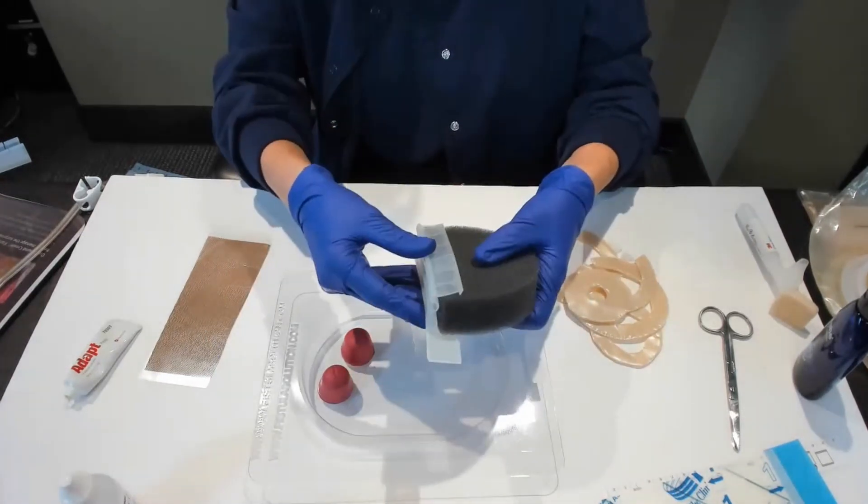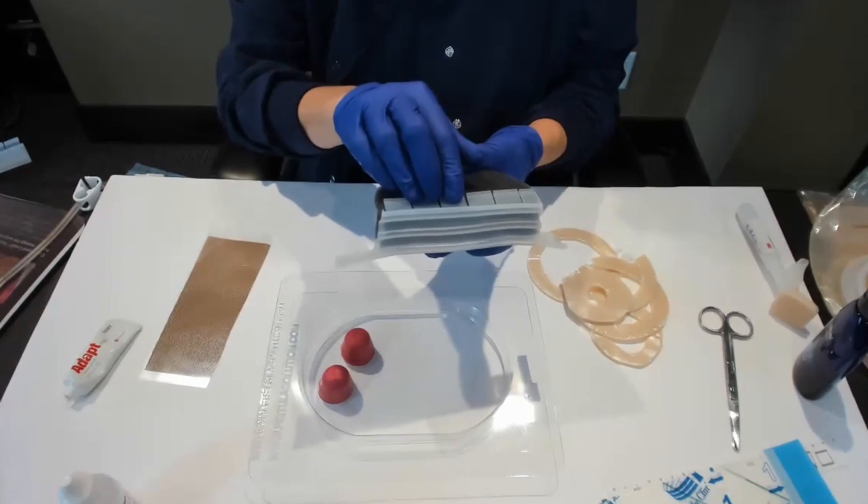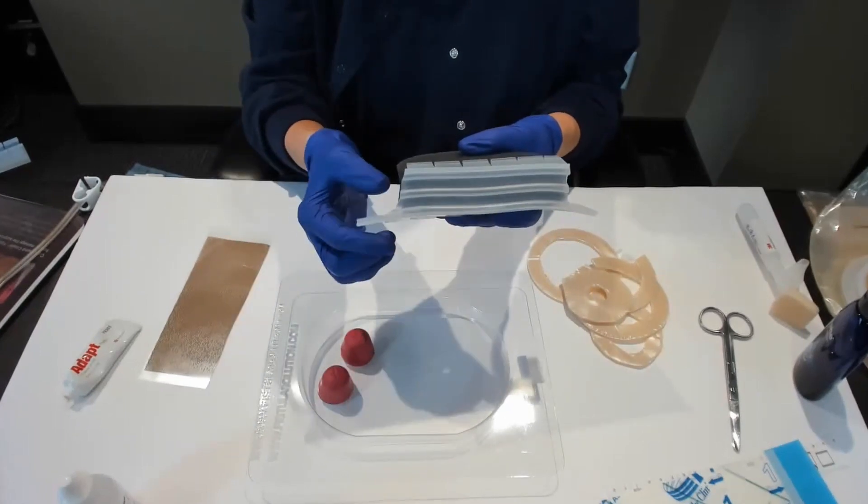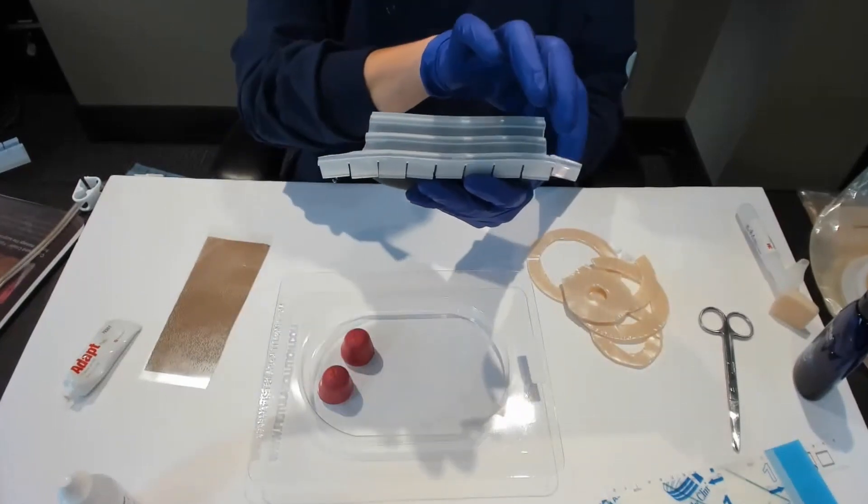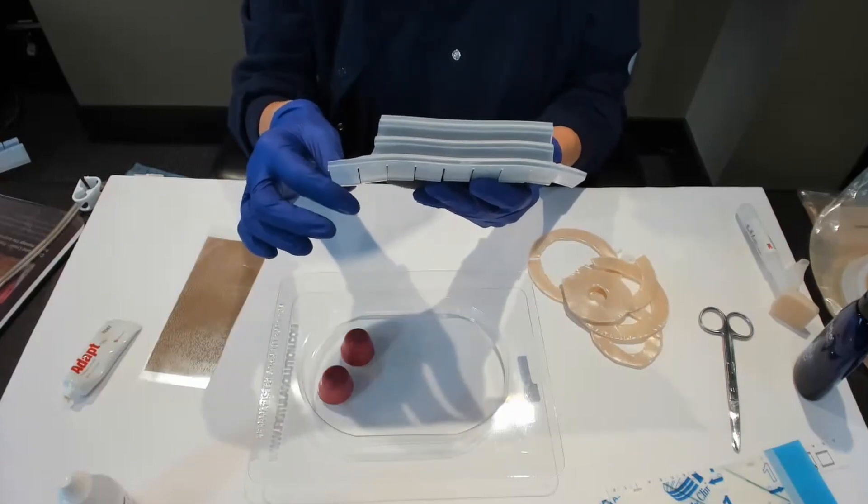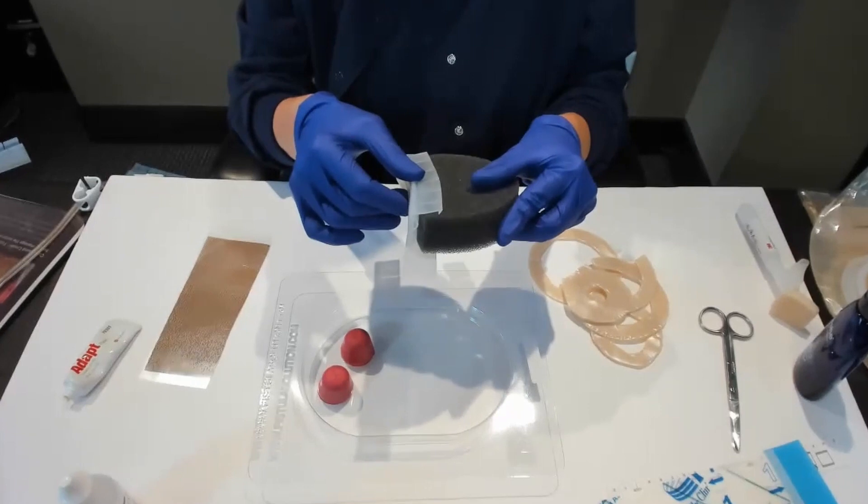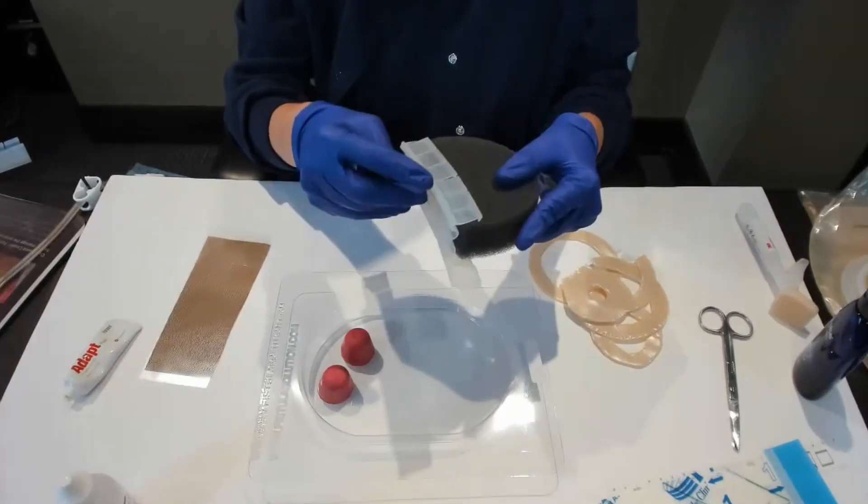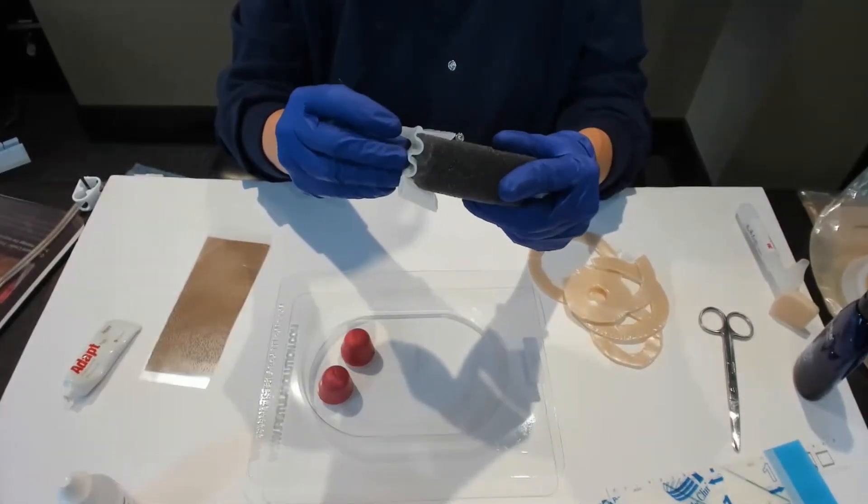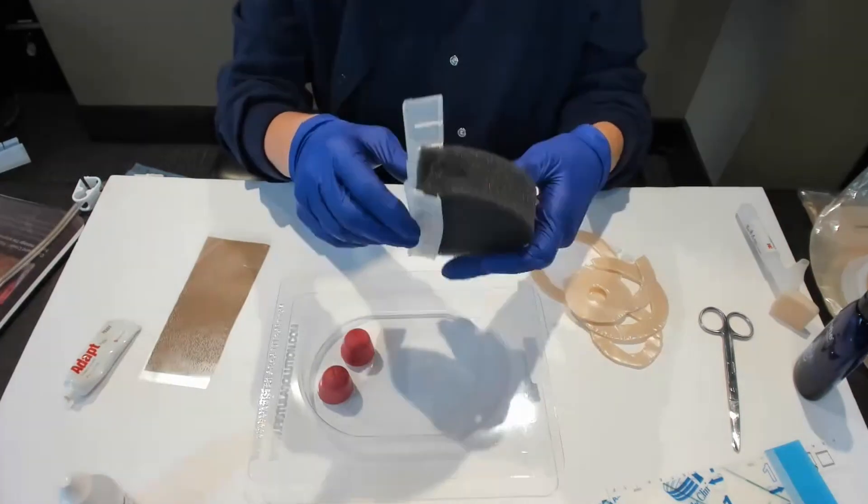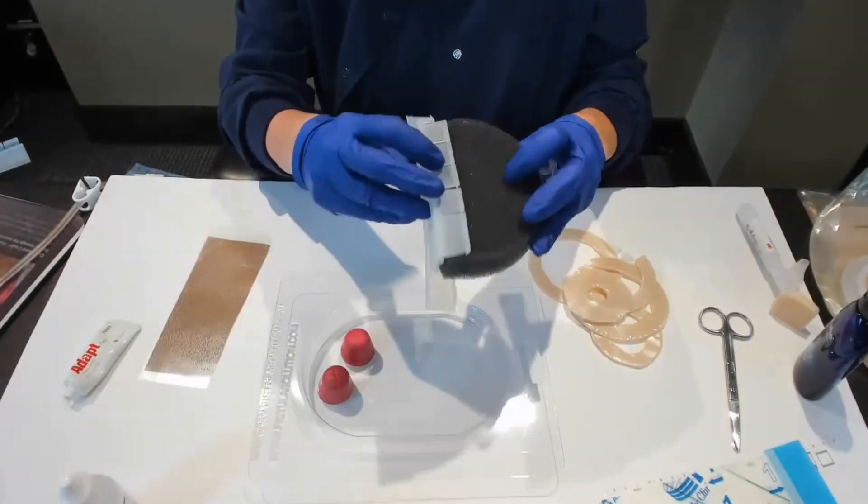I've trimmed the isolator strip so that the petals are still going to sit on the wound edge. The isolator strip obviously is going to isolate the negative pressure foam. The little ridge is on the bottom part, which is going to go against the wound.